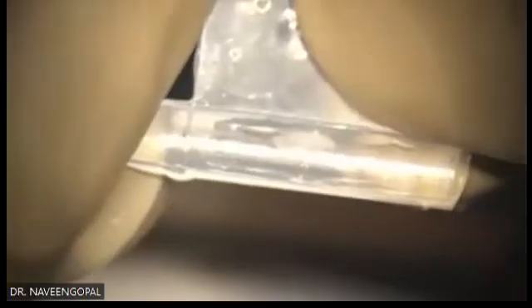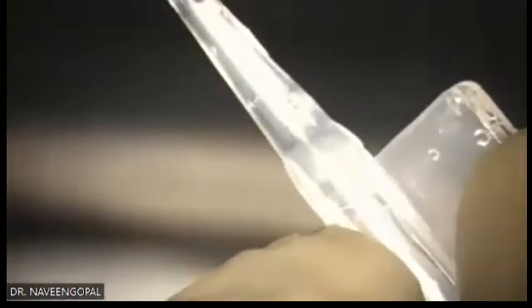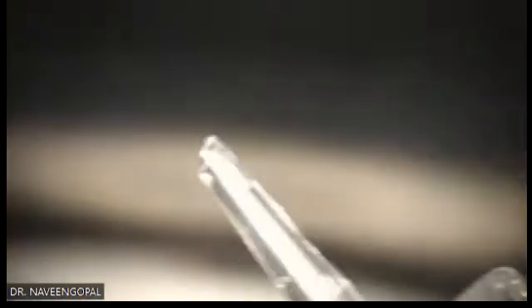You can close and see again under the microscope. No part of the ICL is stuck to the ridges. That is a very important step before you put it in, and your hole is towards the left. This is your left. This is towards your left. This is a very important step before you load it.